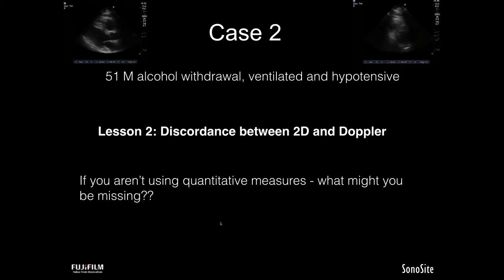Now, this is a case of volume administration. This isn't apt to have led to death if it went unrecognized, but there is a tremendous pleasure, as we all know, in identifying the actual cause of the patient's problems and identifying the root physiology at the bedside, especially now that we've abandoned invasive monitoring largely in critical care areas. This restores that quantitative and precision instrumentation that I think many of us have been missing.